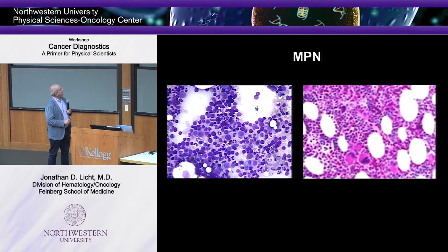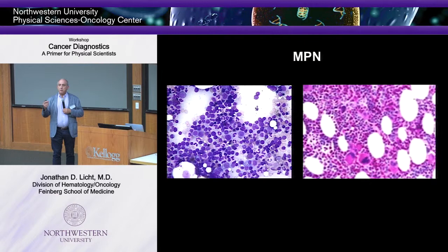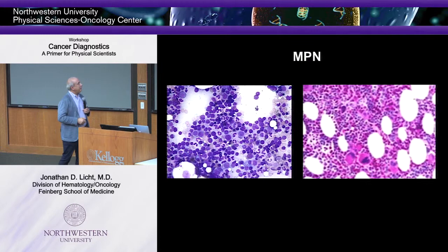And these cells here that look like horseshoes, those are cells that are almost mature white blood cells, ready to fight infection. And in normal bone marrow, what's happening is that the very immature stem cells, these big round ones, divide, and one of the daughter cells goes on its way to become a mature white blood cell. And one of the cells stays as an immature cell and can renew itself. By contrast, oh, it's a little fuzzy here. One thing you can see over here, this is myeloproliferative neoplasm.